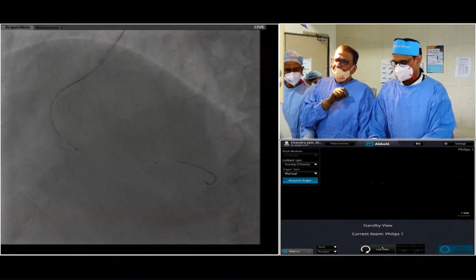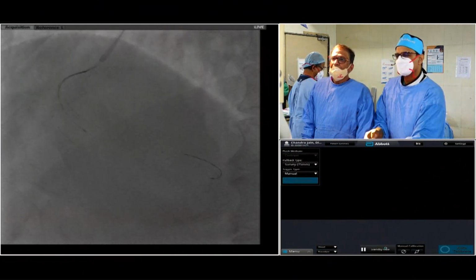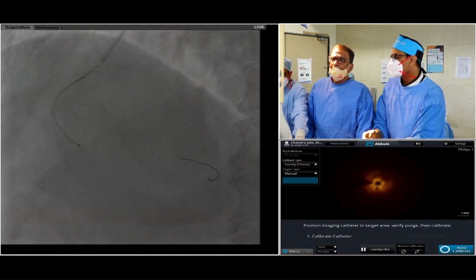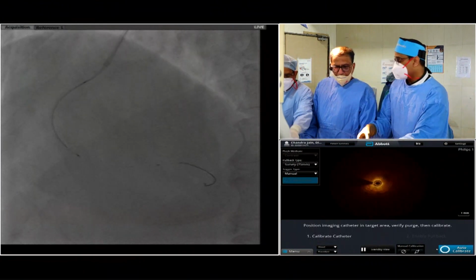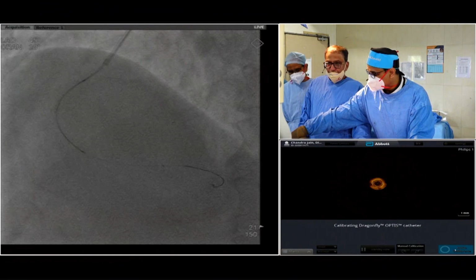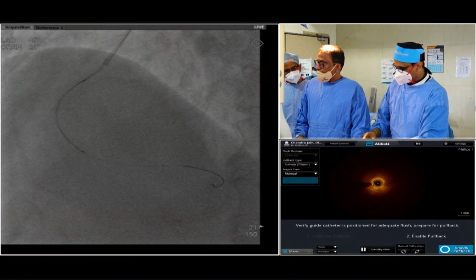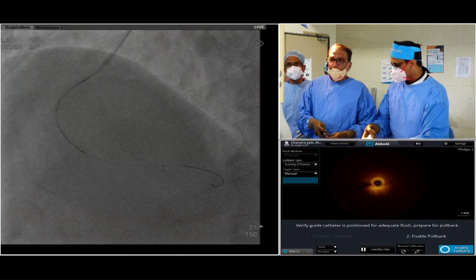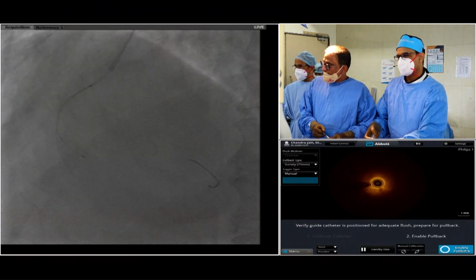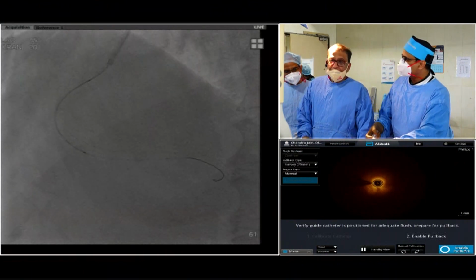When you go with cutting balloon, what is the highest pressure that you go to when you say high pressure? Clearance, please? Yes, we are okay. Fantastic. I have not injected any contrast. I just check on the live image whether I've got clearance from the OCT, just 2 ml injection. You're doing the saline injection again? Yeah, 20 ml saline injection. Are you ready? Yeah. Okay.